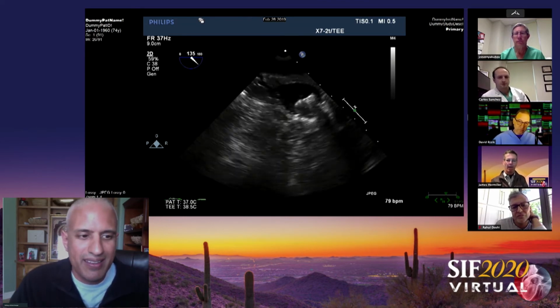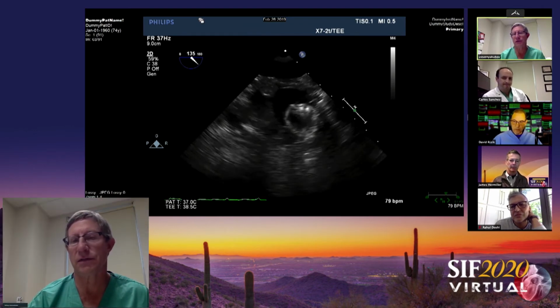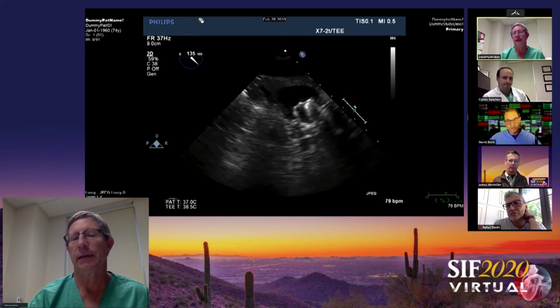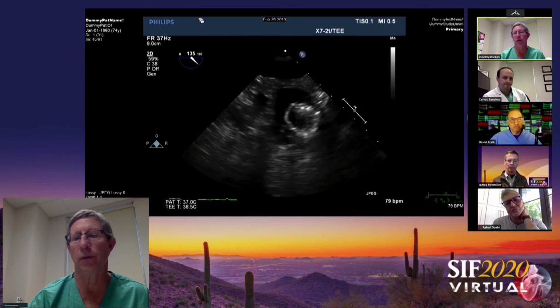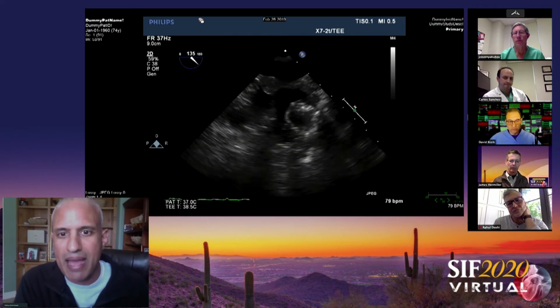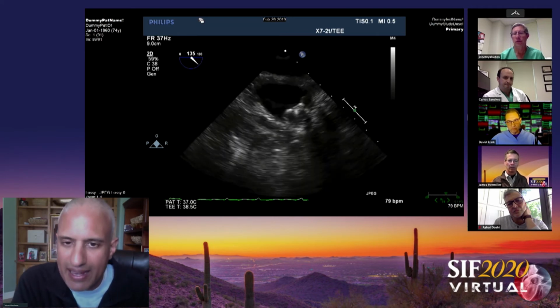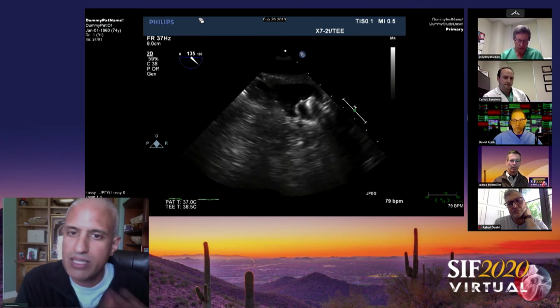So now I'd really be worried about your size, Srinivas, because there's nothing that keeps the shoulders from being expanded angiographically, and all of a sudden you're missing a whole posterior lobe or posterior placement. Right, exactly. There's your live feed there. You can see clearly that gap. It's massive. So we missed that entire lobe, even though it's canted out. So again, this is one of those cases where at this point, guys, how would you approach it at this point?